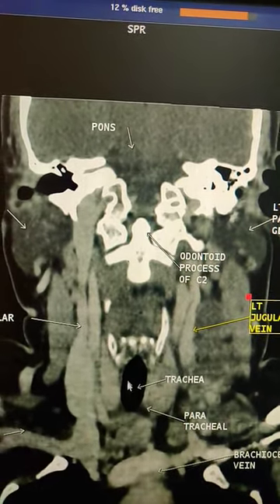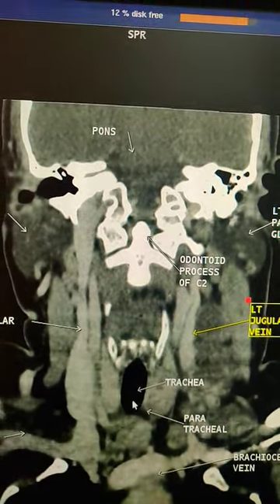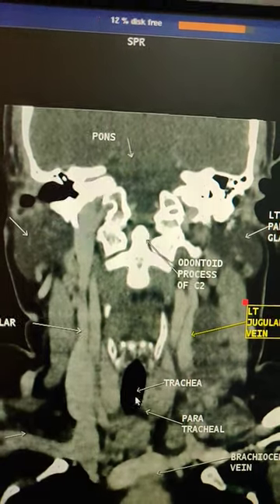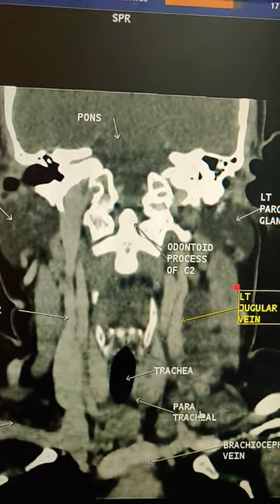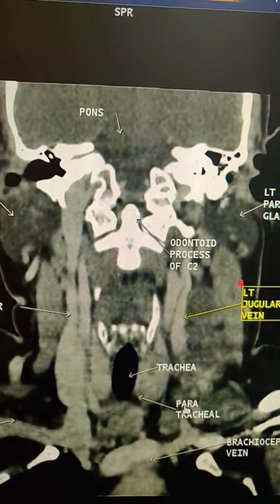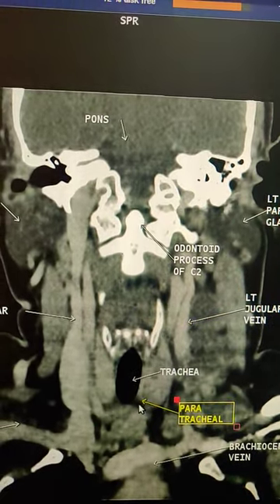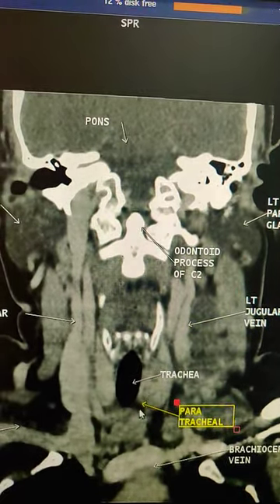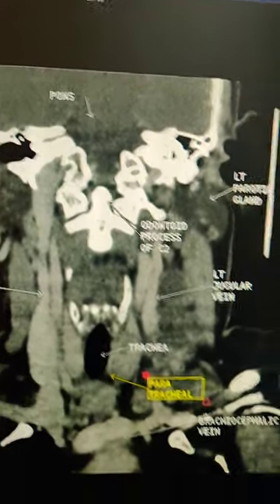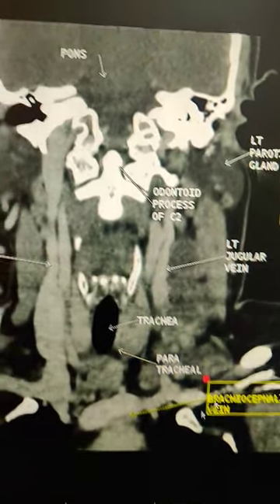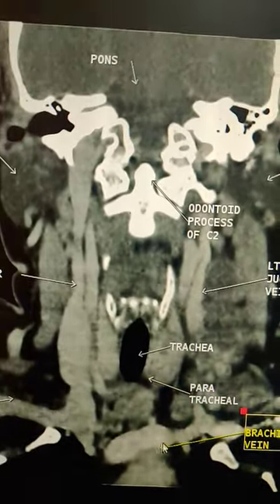Trachea. This is air, and this is trachea. Parotid gland area. Brachiocephalic vein.